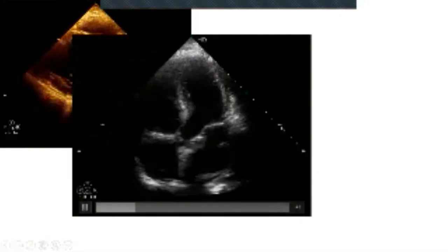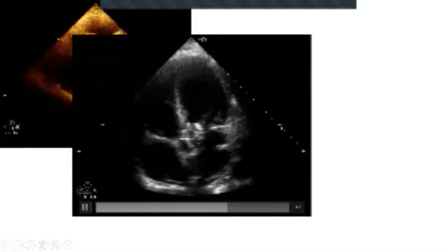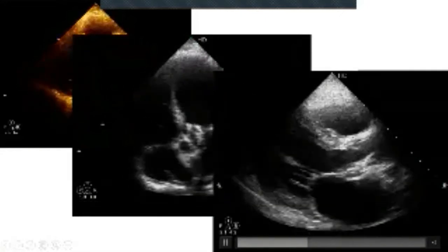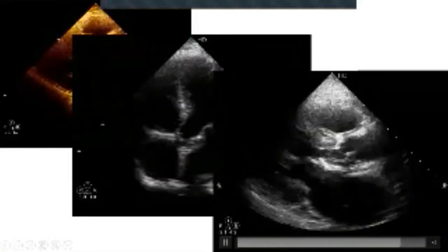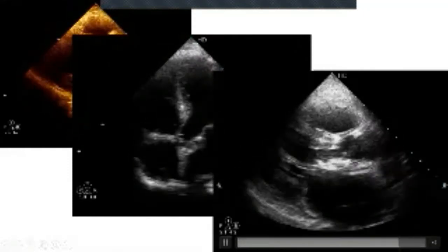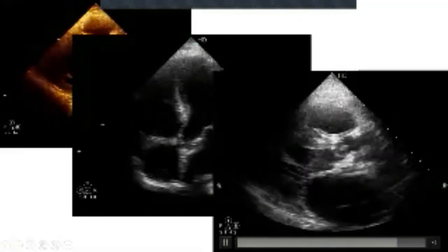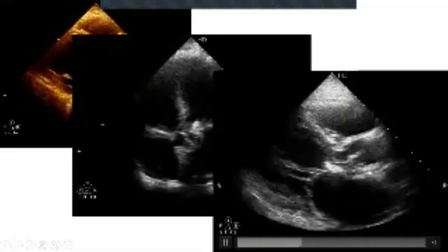Here we can find the cavity. This cavity is at the attachment of the prosthetic valve, and this cavity is abnormal. Here we can see a native valve with two very large vegetations in this apical 5-chamber view. And when we change to the parasternal long axis view, we can see one cusp is destroyed, one cusp has a vegetation, and the other large, highly mobile vegetation is attached to the LVOT.